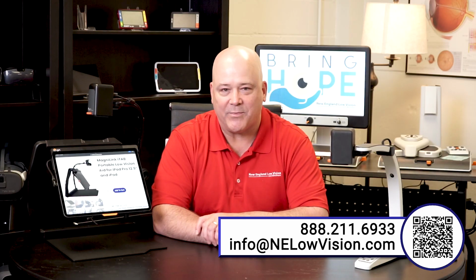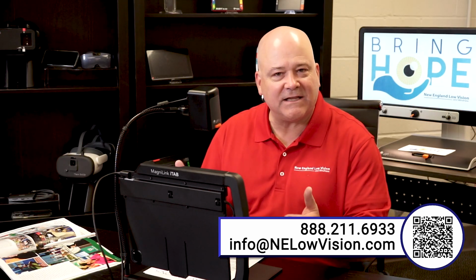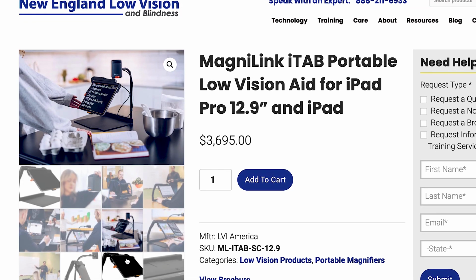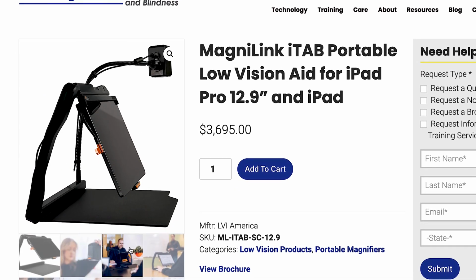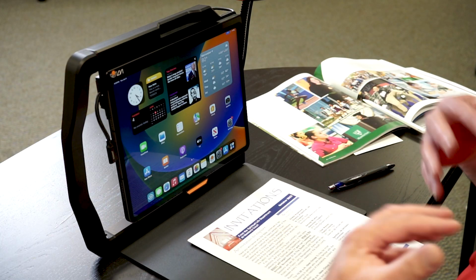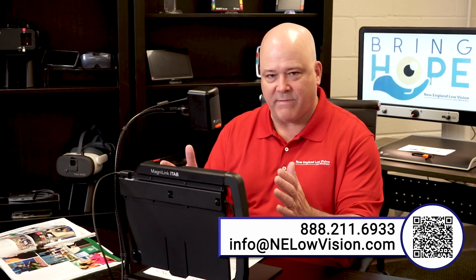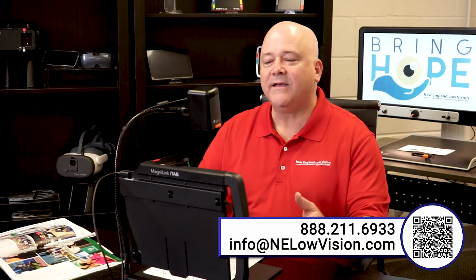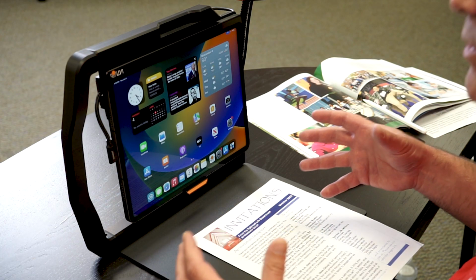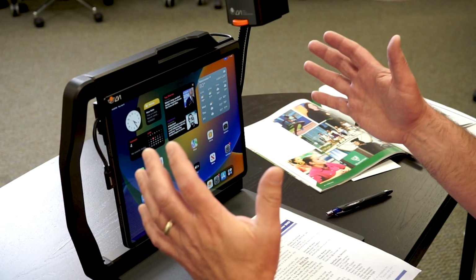So let's go into it a bit more. Here I have the MagniLink iTab set up in its inline position. Almost all of the photos that you'll see are in the other position, which has the camera to the side. So I wanted to make sure that you saw the way that I prefer it to be set up, where you have the camera inline right in the middle of the monitor. It's designed in this setup to work more intuitively with how most of our minds work. So this is the inline position.